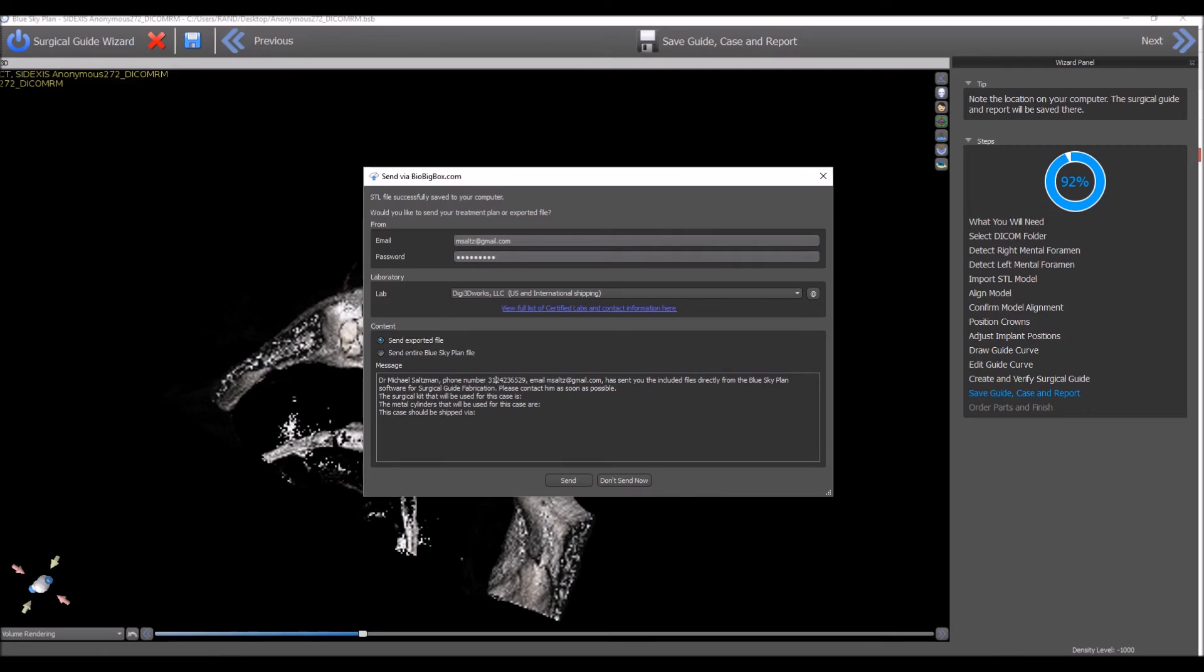You should also include information regarding the surgical guide that you're going to be using, the metal cylinders, and shipping information. Just go ahead and type that information into the message box as well.